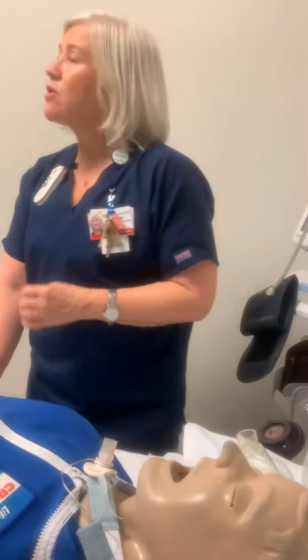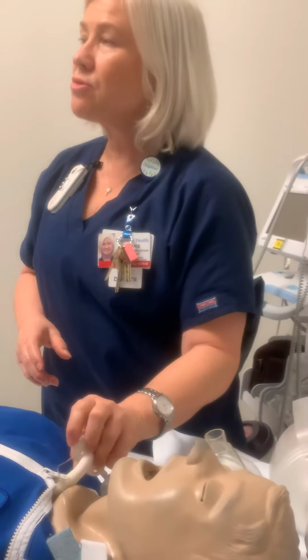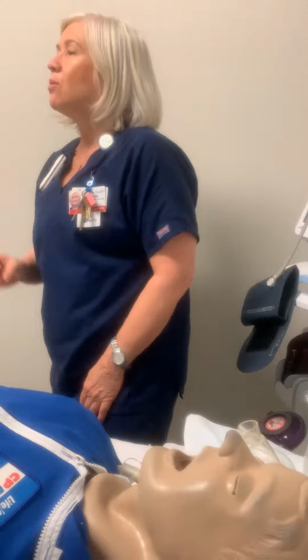So let's start with our first altered airway. So we have a tracheostomy tube in, but you have a patient here and this maybe pops off right here. Now your trach tube comes out. What are you going to do? Your tracheostomy tube comes out. What are you going to do?